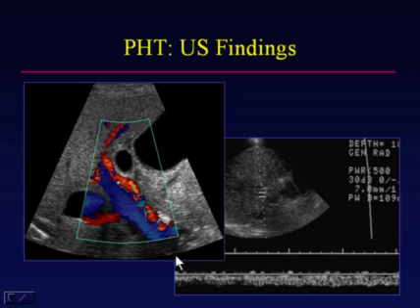On these images, you can see that the flow in the portal vein is opposite in color to flow in the hepatic artery, so it is reversed on the color image, and it is below the baseline on the spectral tracing, heading in a direction away from the liver capsule. So again, this is the appearance of reverse flow in the portal vein on the spectral Doppler tracing here, as well as the color Doppler image.